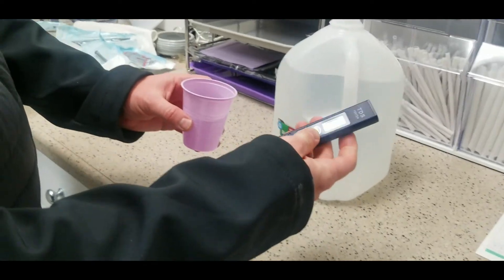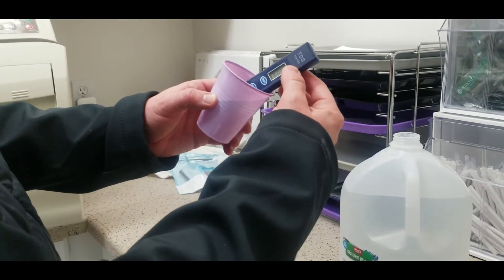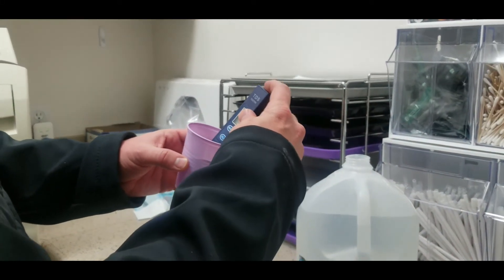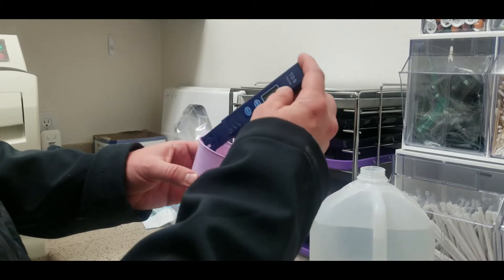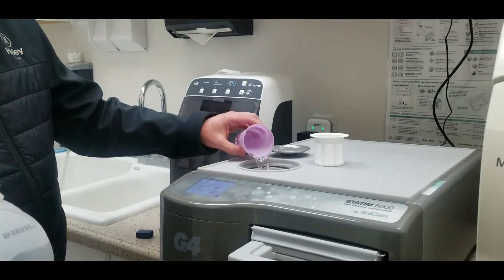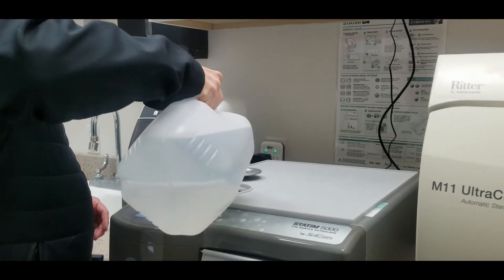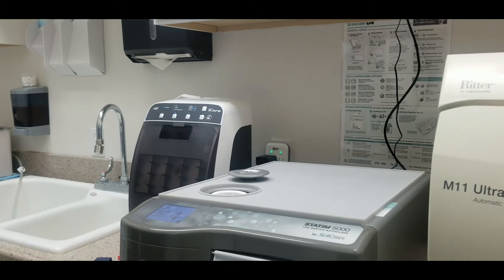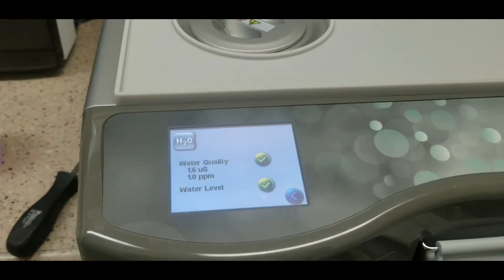We're putting some distilled water in a cup and measuring the TDS level with the total dissolved solids meter — it reads zero. That's what was coming out of the zero water filter when it was working correctly, but you have to continually test the water as it comes out of the filter to make sure it never goes above zero. We're running this zero TDS distilled water through the autoclave to ensure there are no impurities in the tank.